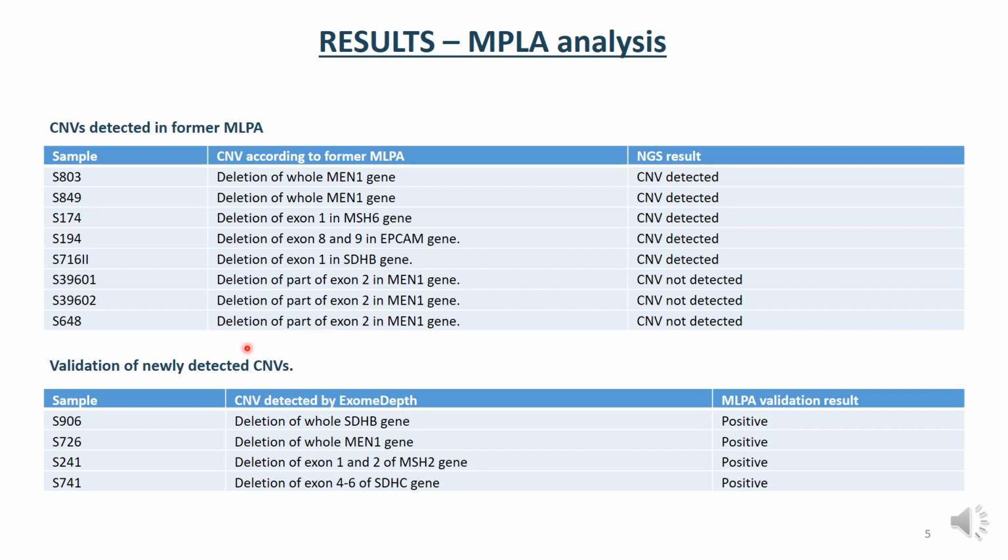Here we can see another few samples which were first analyzed with NGS, and in all those samples, the deletion was detected. And then the MLPA validation was performed, and the validation result for all those 4 samples was positive.